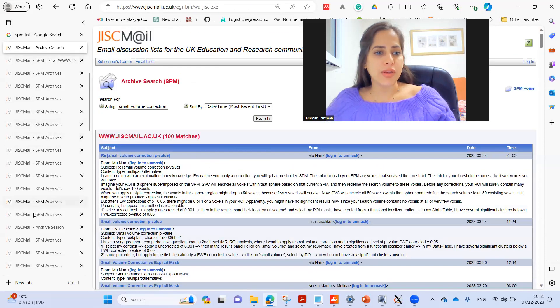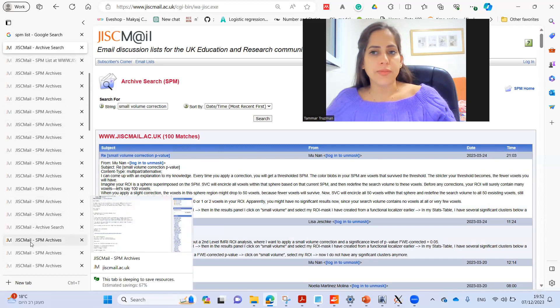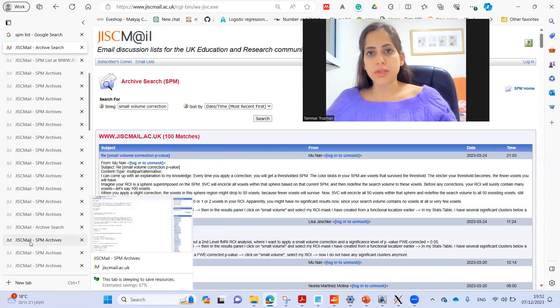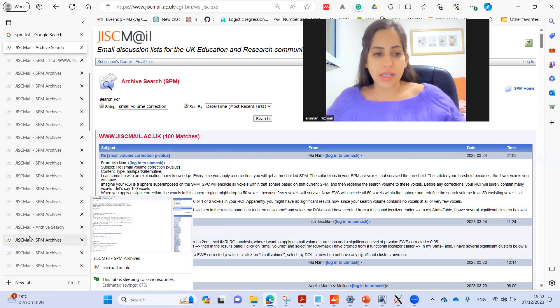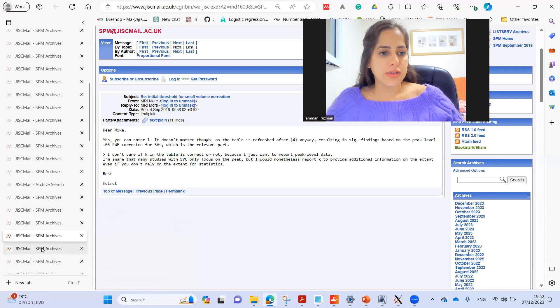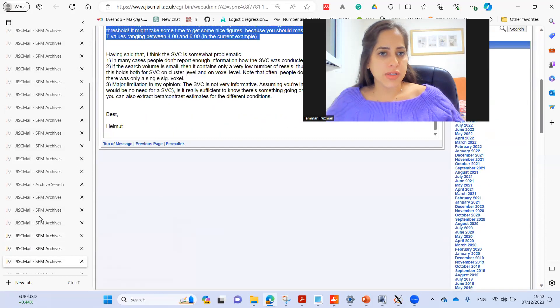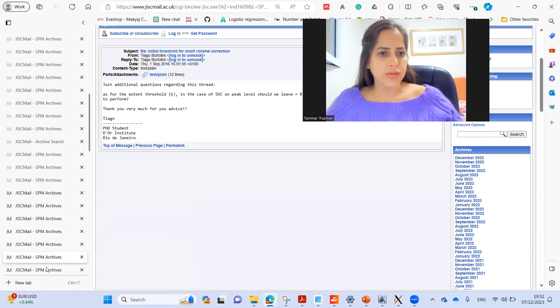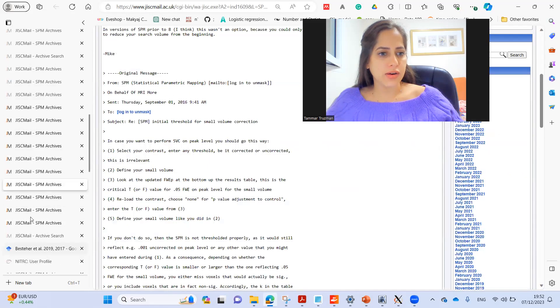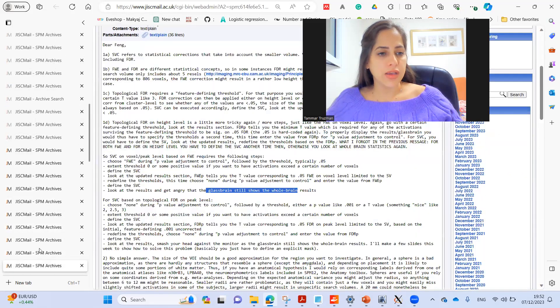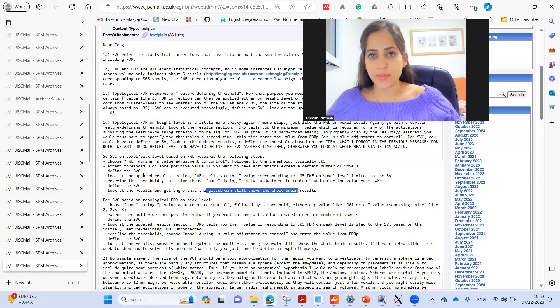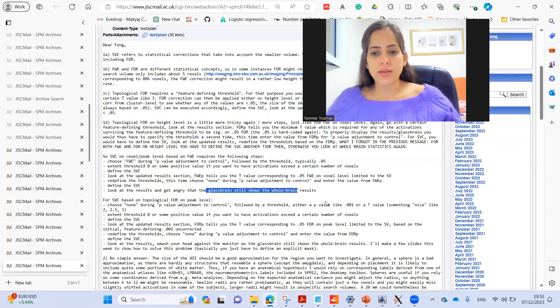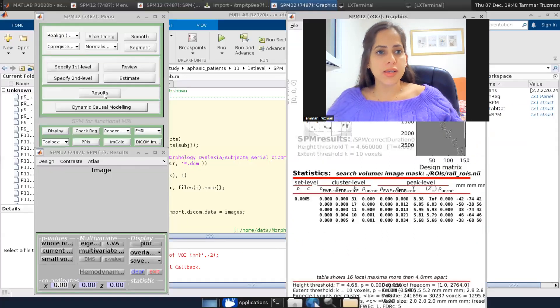So as you can see, I've got many, many, many results that includes the small volume correction string. And I looked at the responses of Helmut and there I found the exact way for doing this in the SPM.